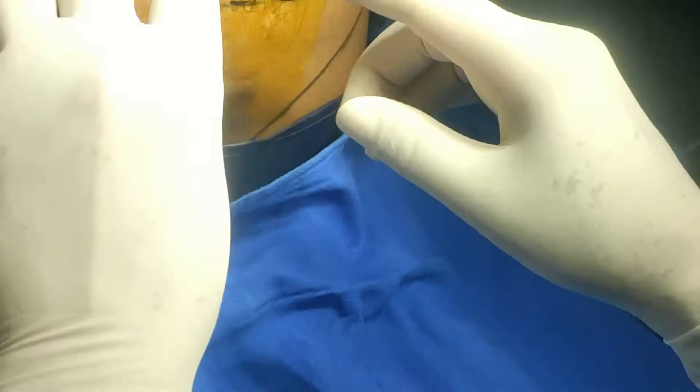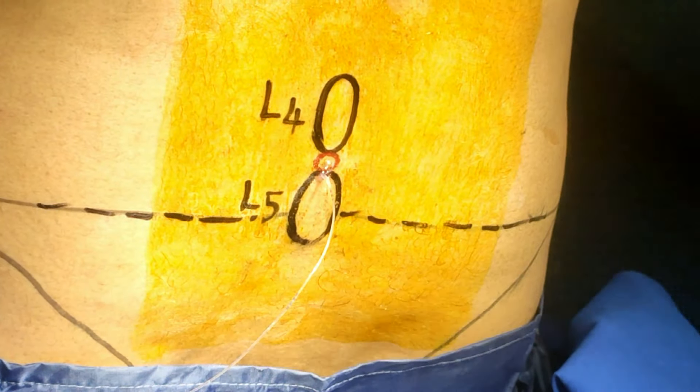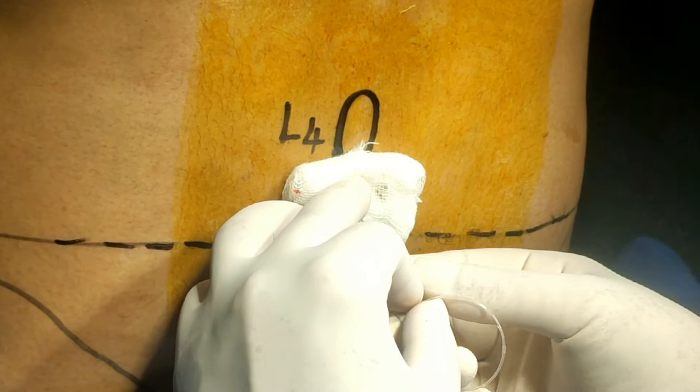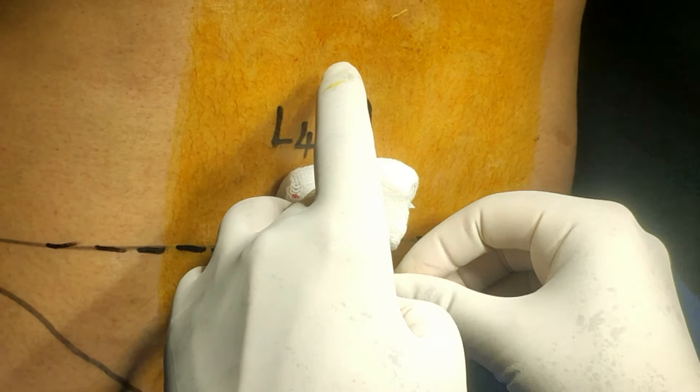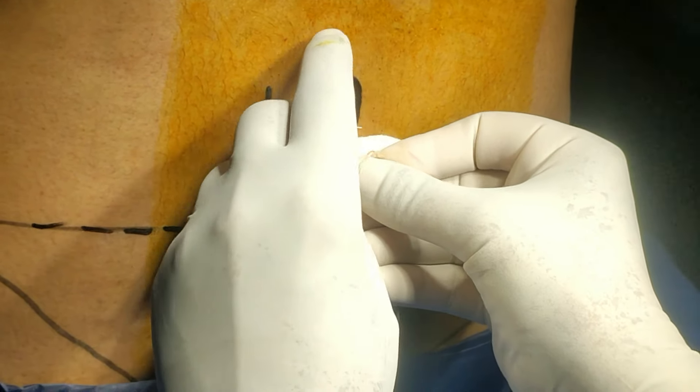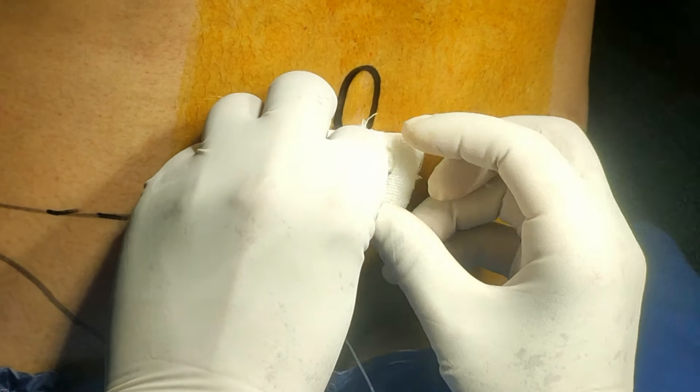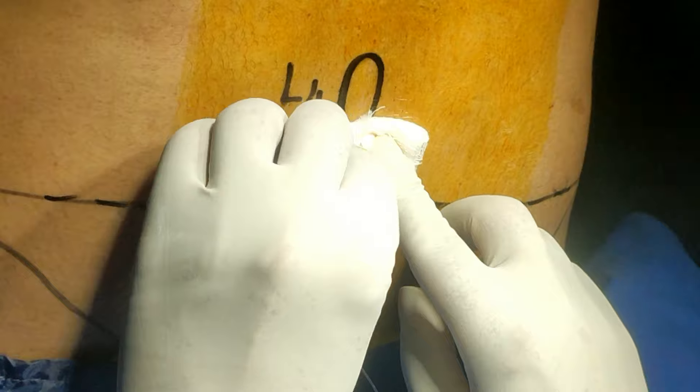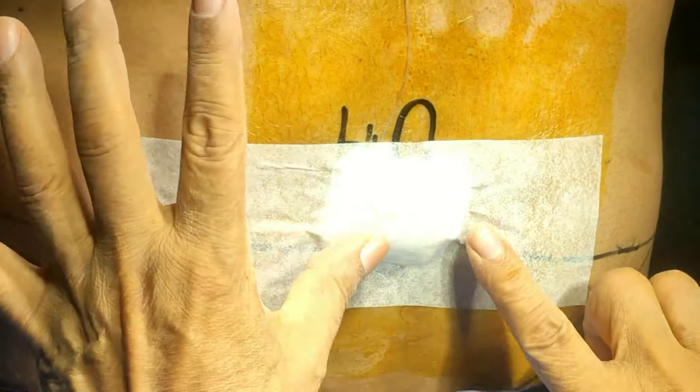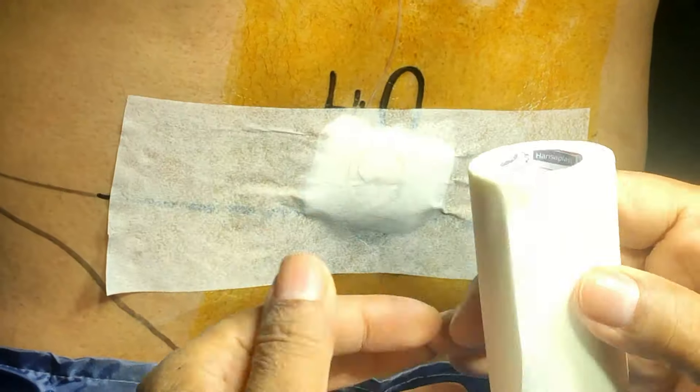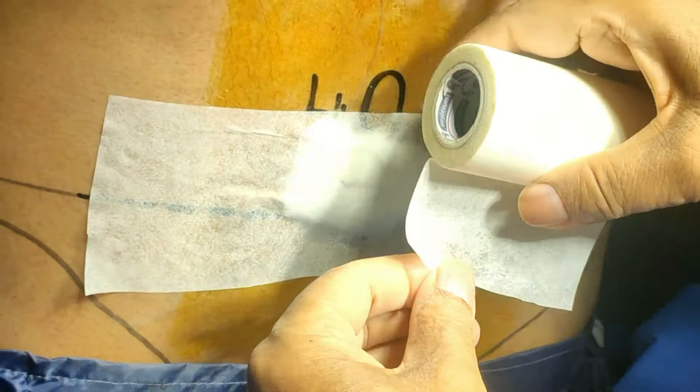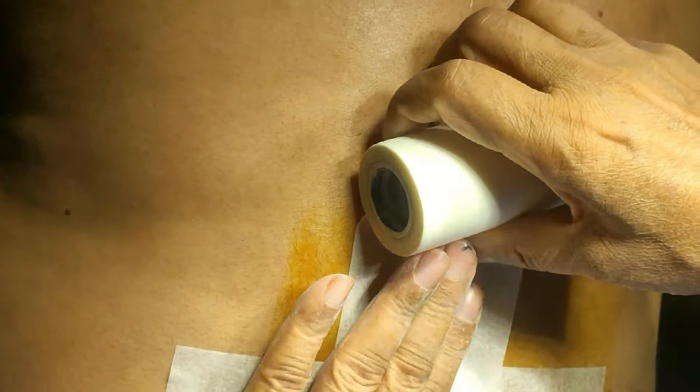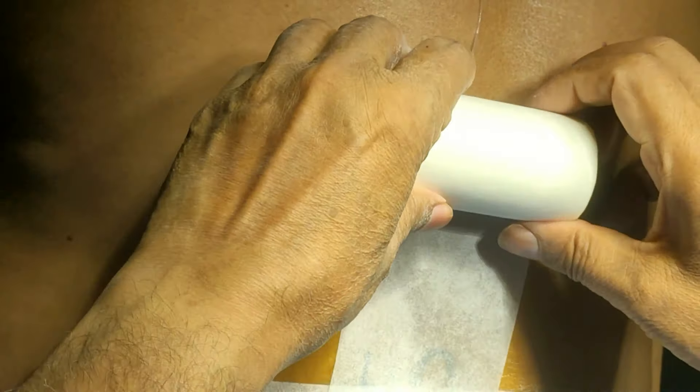Now just fix this and apply the tape. Make a loop here. Because I have added the pad there, now take the loop. Keep this catheter in the center. Now keep this setup in place. Thank you.